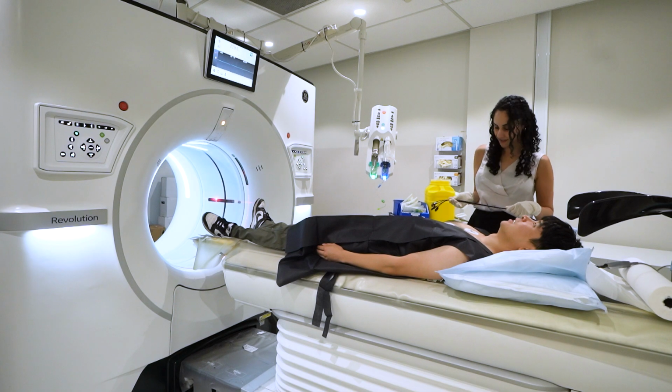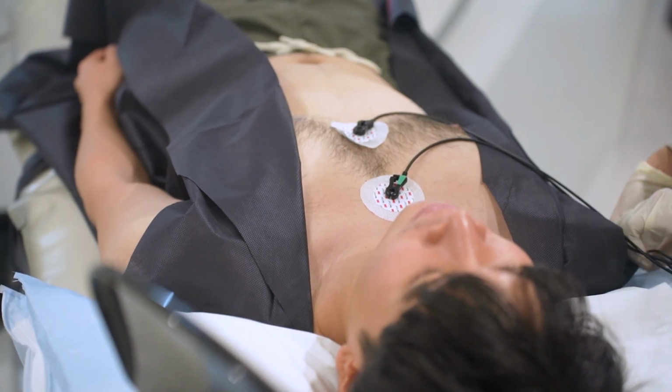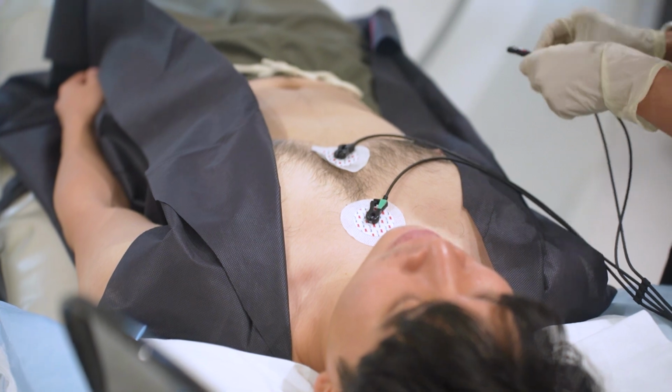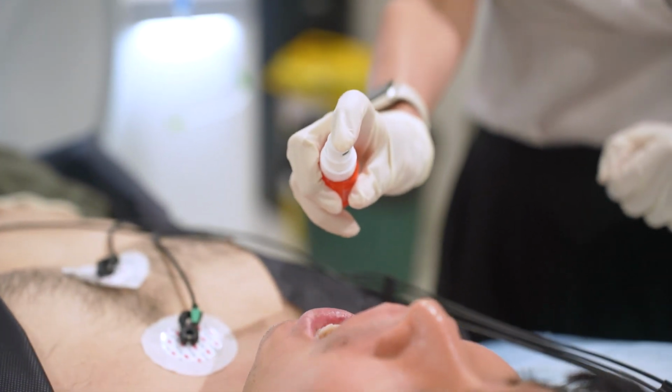During the cardiac CT procedure itself, you can expect the scan to be relatively quick and painless, lasting only between 10 to 15 minutes. You'll lay on a table that slides into the CT scanner, which looks like a large donut. The technician will place electrodes on your chest to monitor your heart rate during the scan. If you're having a CT coronary angiogram, the technician will administer a medication called nitroglycerin under the tongue, and that will dilate the heart arteries.